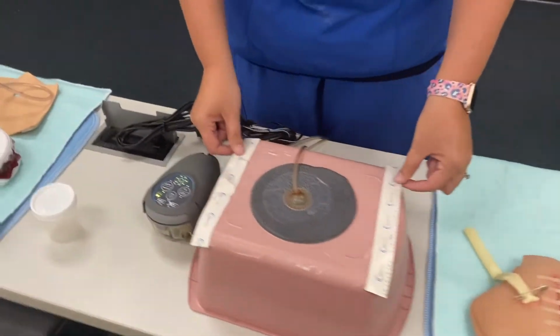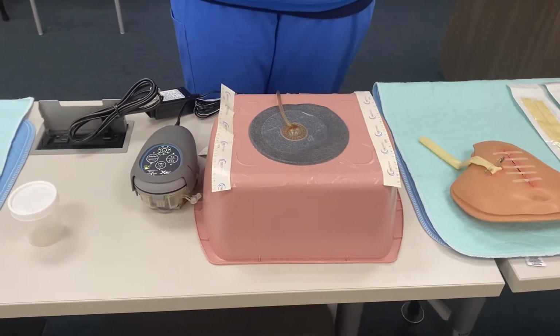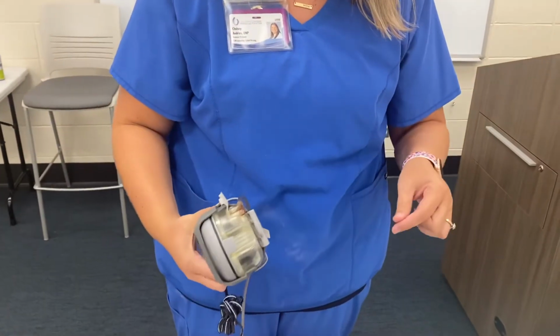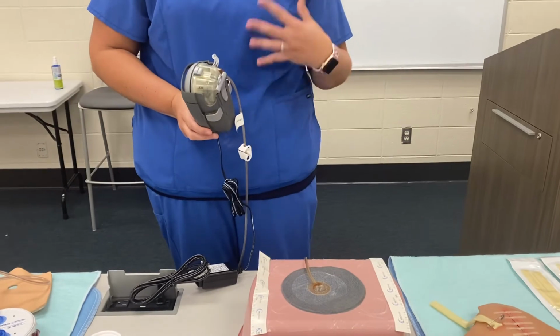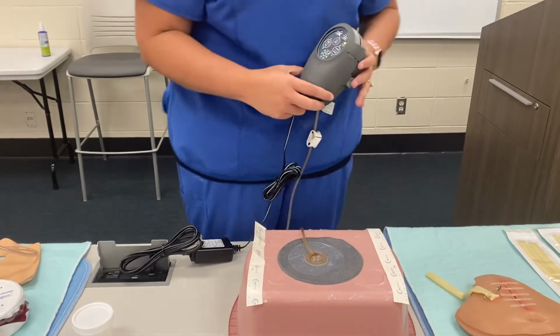Next, we have the wound vac, and you'll see we actually have this set up and running, so you'll be able to look at it. And this is one like a patient would go home on. So remember Miss Kennedy talked about these patients usually have these long term. It's an incision or a wound we just can't get to heal properly. And so this is a home wound vac.